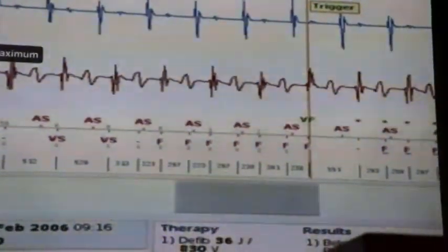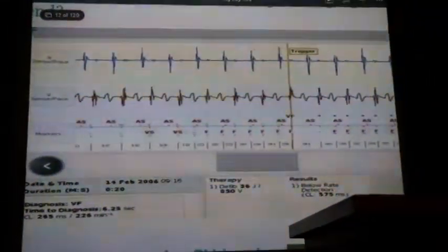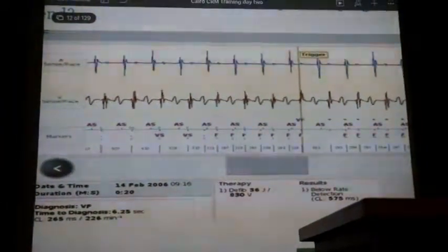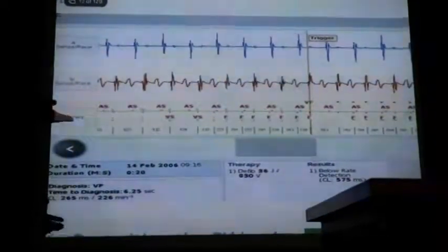So we've got some T wave over sensing. And the R wave here? Imagine the R wave is 3. So the device is going at 50% of 3, it's 1.5, and then declining down. And this is almost always what you see. Almost always, if you get T-wave over sensing, it's this.